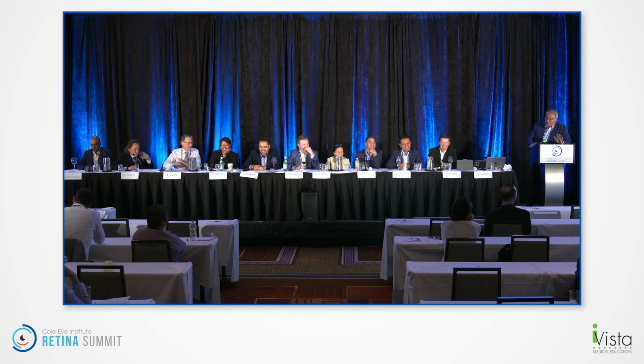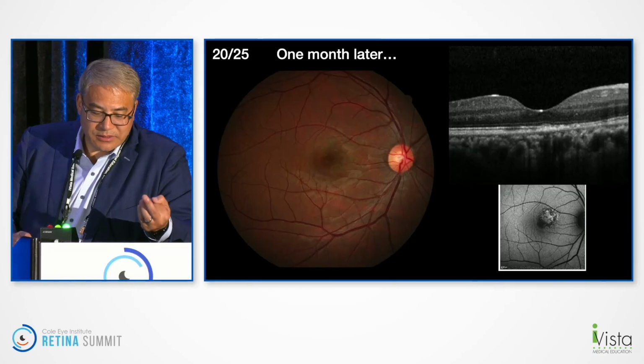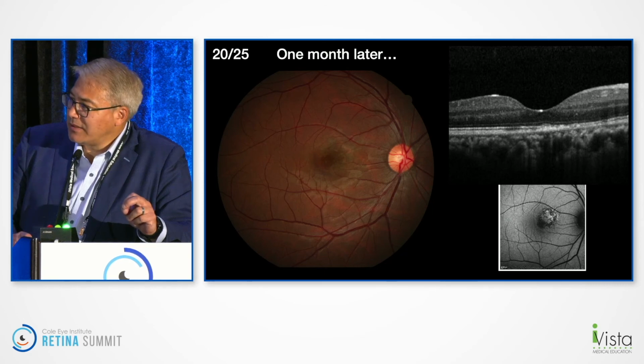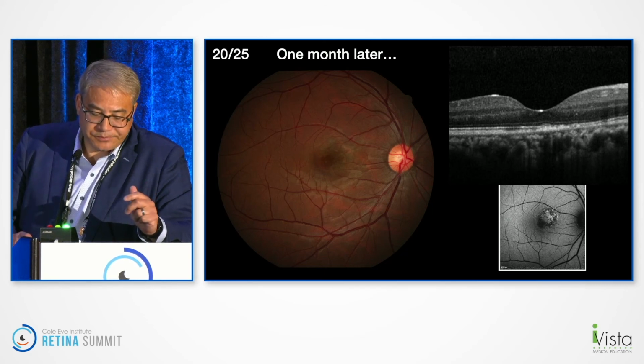Here, OCT. Anything there? Nothing. About a month later, here's the OCT. Have you guys seen this entity ever? Oh, I'm stumping some people here. Did he have any rash on his hands or feet or anything? No, but he had this viral thing. Was he really high fevers or not so high fevers? Not so high fevers. Got a pretty ratty EZ line, huh? That sort of bullseye-like pigmentary change. Yeah, exactly. They didn't have a rash? No rash.